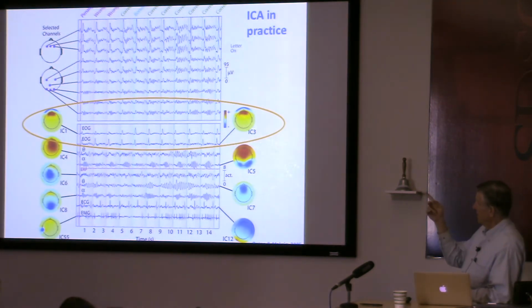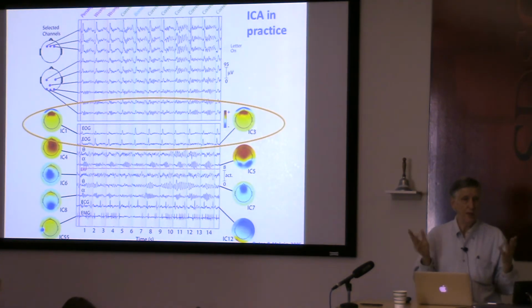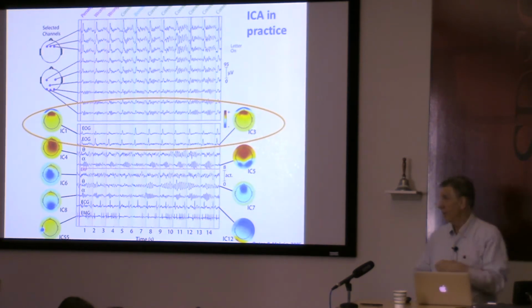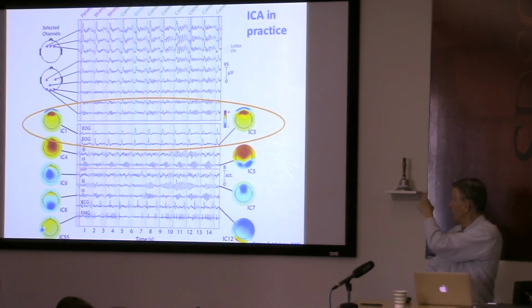And it means that ICA found the most independent basis possible for those, but it failed to find an independent basis. Examples of that could be activity that was moved around, or in this case it had some temporal sequence that was slow enough to be captured by EEG.